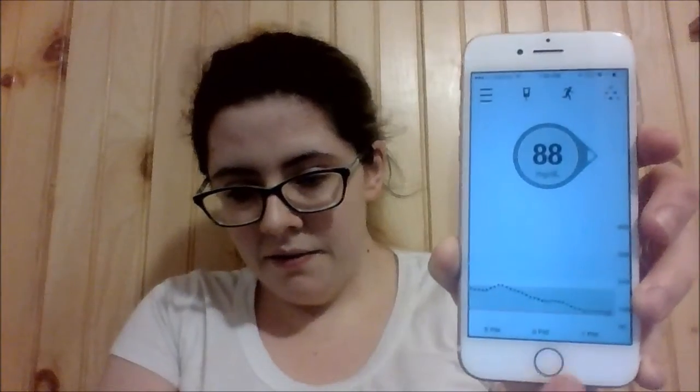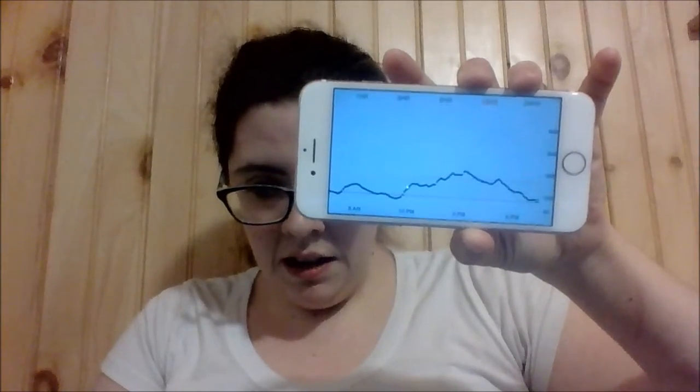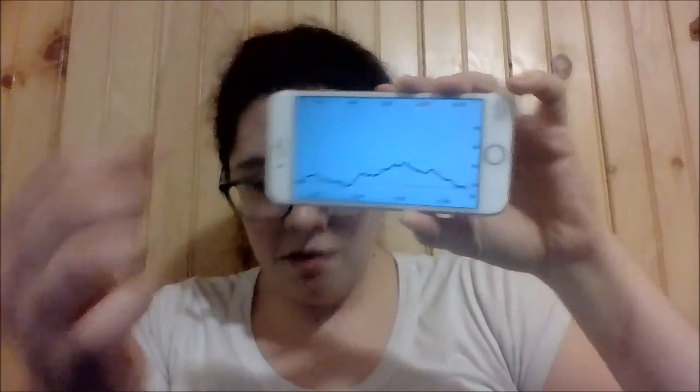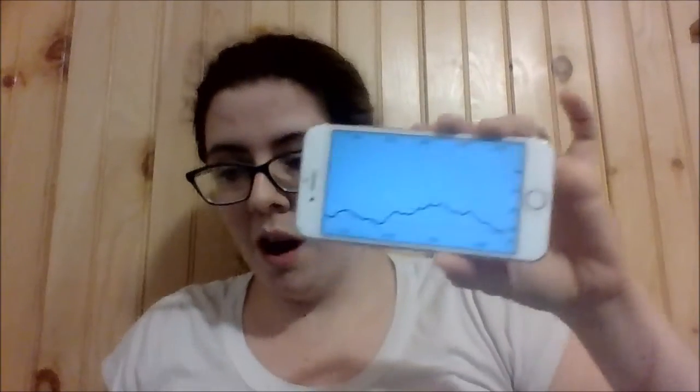And there's the graph that I was telling you about that's on my receiver. If I turn my phone, it'll give you 12 hours right now. It has the option of an hour, 3 hours, 6 hours, 12 hours, and 24 hours. You can look at the graphs. Alright.